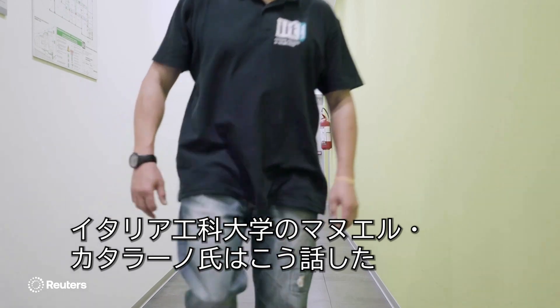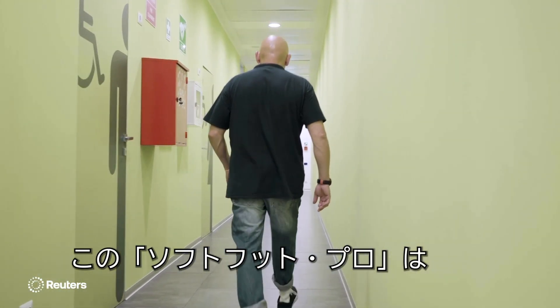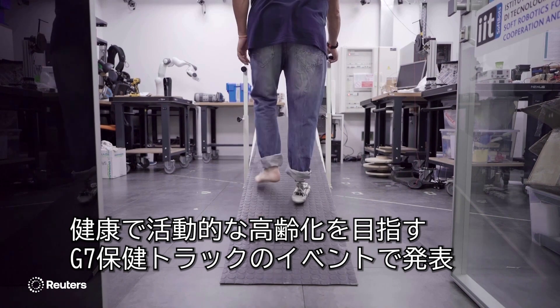That's Manuel Catalano, a researcher at the Italian Institute of Technology. They recently unveiled a prototype, better known as the SoftFoot Pro, at the G7 HealthTrax technical event, which focused on innovations for healthy and active aging.